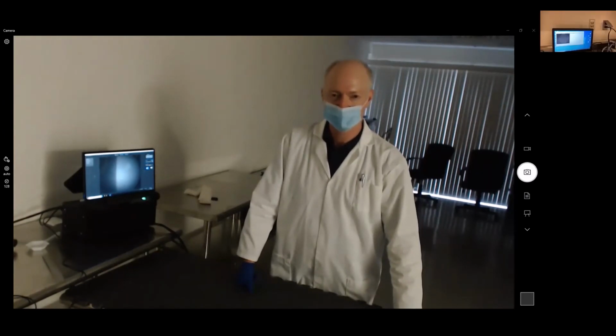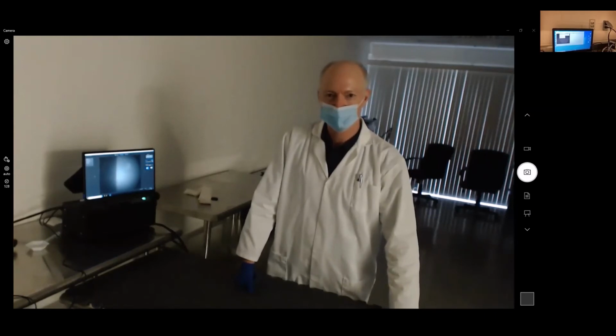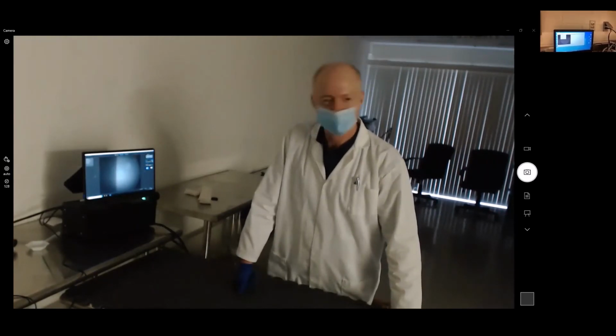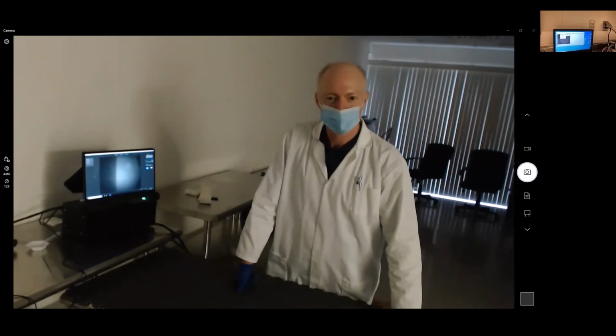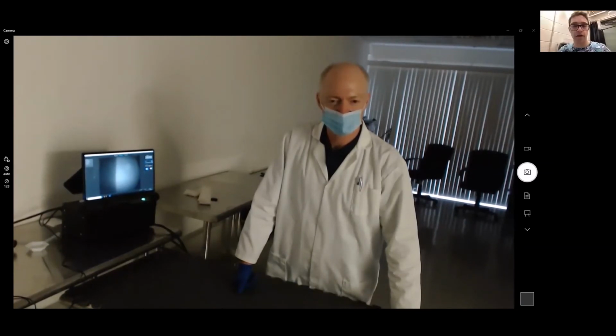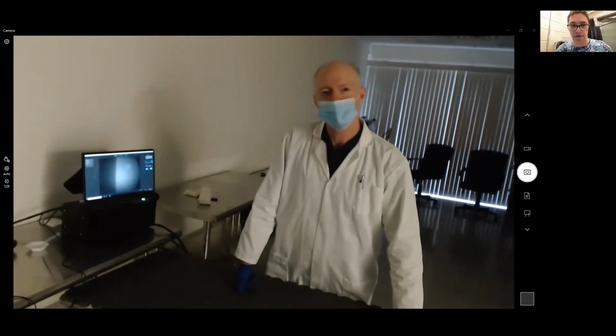So for that setup, I have it in front of me right now, and I'm having the set measurement. If I just leave it at 1, it gives me this, and then I can do a measure and set new measure. Or no, draw a new measure. But again, it doesn't have the units, so I'm not sure how to convert it into what distance I am in the retina that I'm taking the photo of. That's the part I'm confused on.